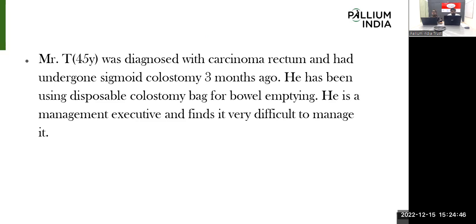Now I'm just presenting a case. Mr. T, 45 years old, was diagnosed with carcinoma rectum and had undergone sigmoid colostomy 3 months ago. He has been using a disposable colostomy bag for bowel emptying. Now he is a management executive and finds it very difficult to manage by changing the bags in between. It's a little bit tough for him.